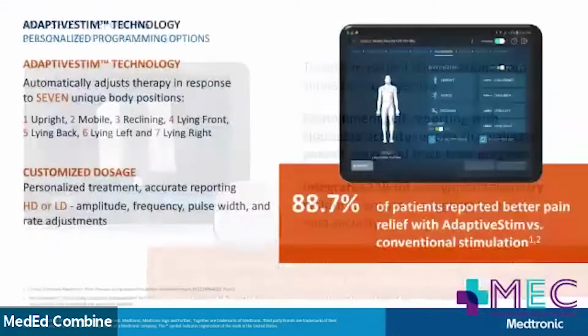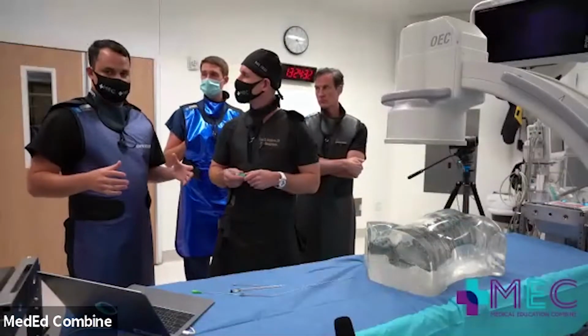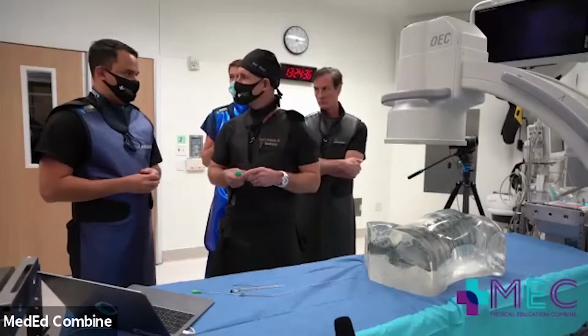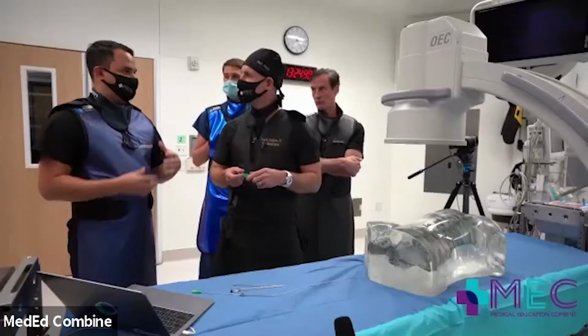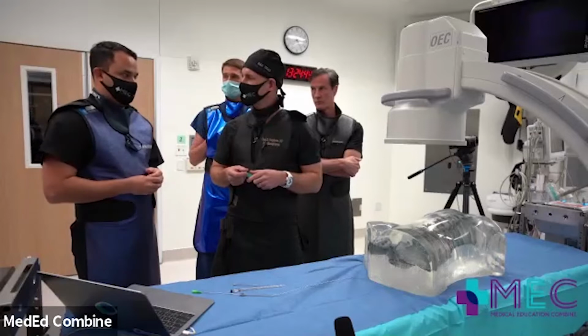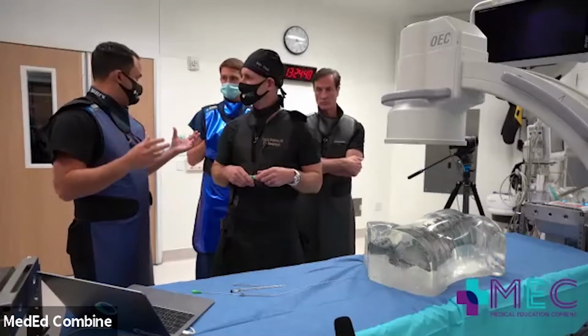Well, I think, too, the rep is an extension of yourself, with any company you're working with, but especially with stimulation. I get a text every day from my rep with how the patient's doing. They talk to my patient 7 days in a row. I talk to my patient the day I did the procedure. So you want to make sure you're comfortable with your rep, that they're hardworking, and that they're going to go out there and help your patient. Your patient's not going to do well if your rep's not on top of your patient and helping them out, because you need to test different types of stimulation, different leads, all that.